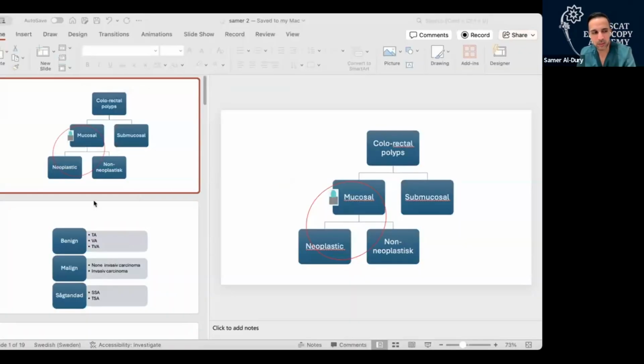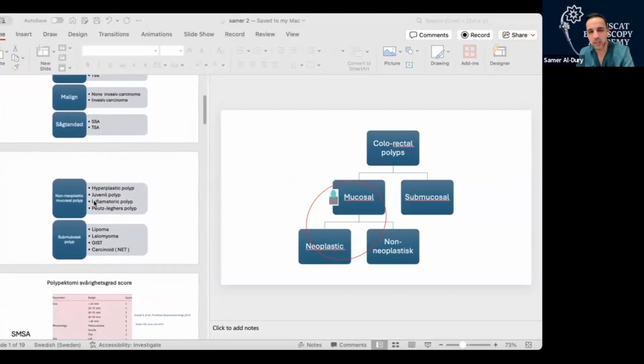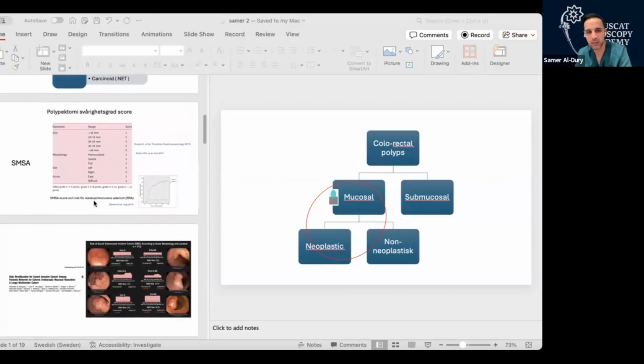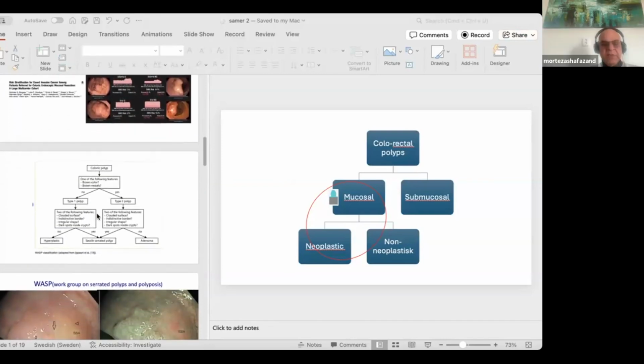Yes, please show us the WASP, and talk us through it. You're an expert at this, so you can talk about this in your sleep. But what is your mental framework when it comes to SSL? Because quite often they're pretty difficult to find. They're hiding.